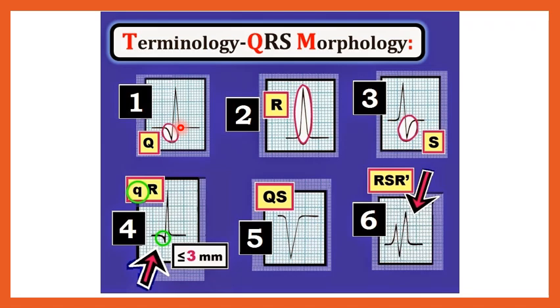Remember, think about the waves on an ocean. The wave is made up really of 2 lines. So when we talk about the Q wave, the wave is all of this. When we talk about an R wave, the wave is all of this. So we really don't have an S, whereas if you look over here, we have no Q, but we just have an R followed by an S wave.